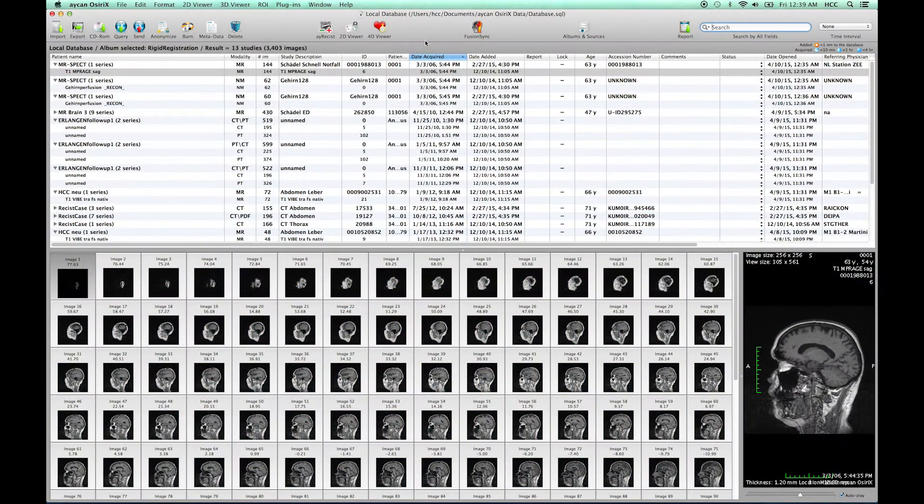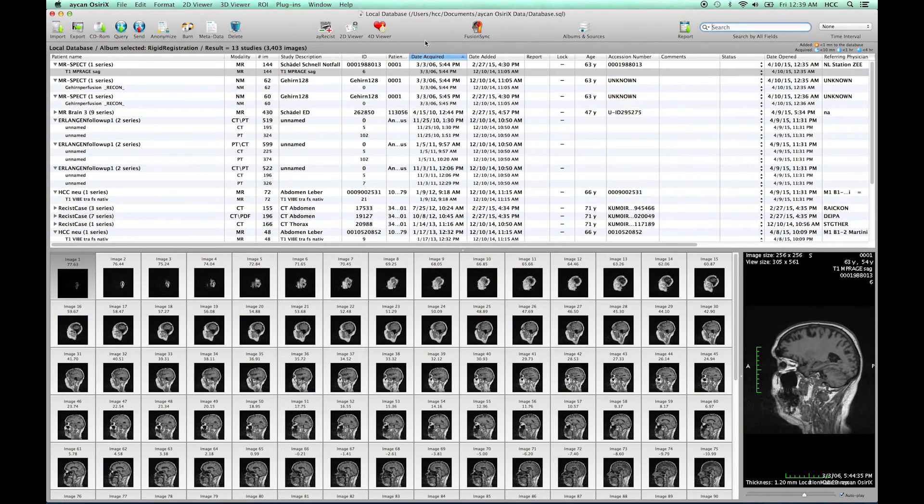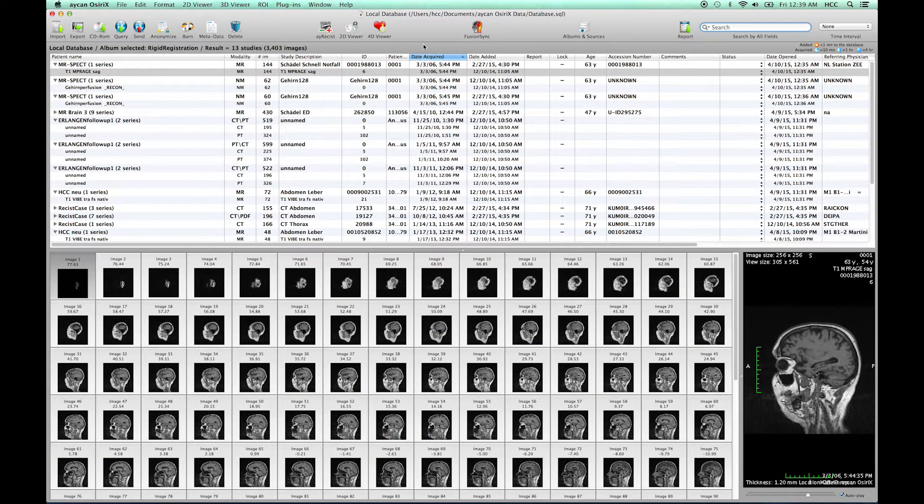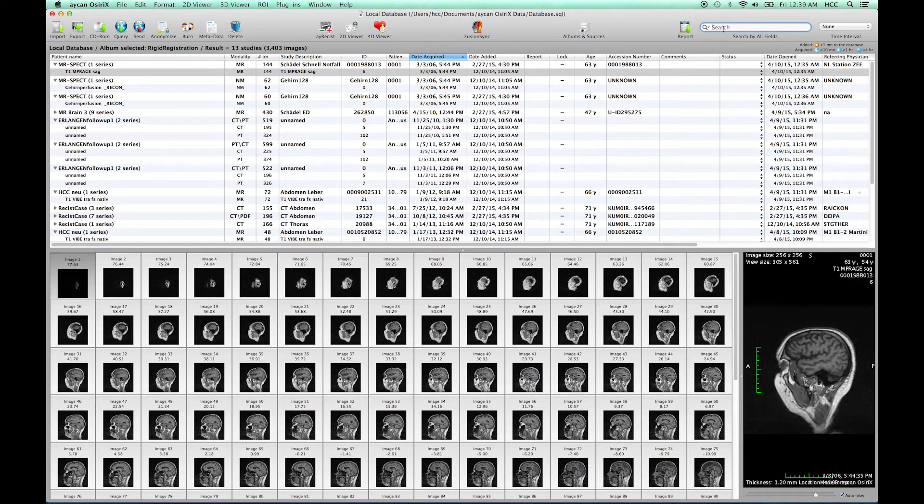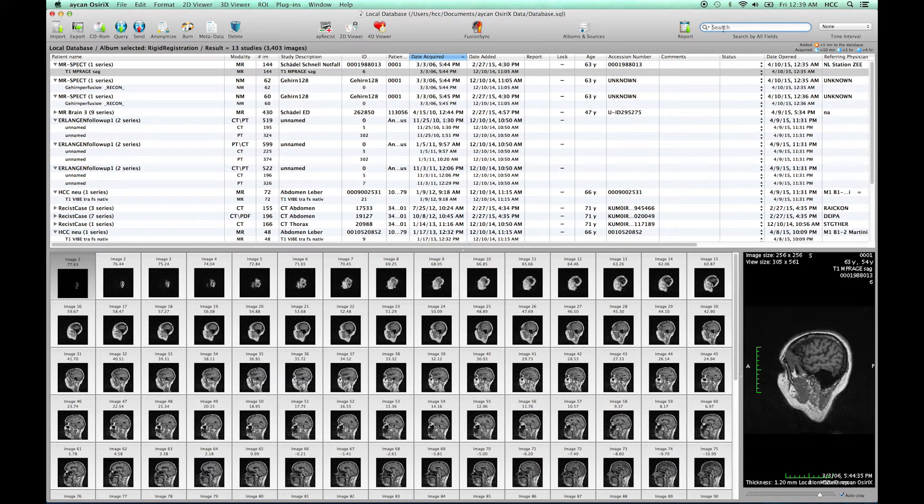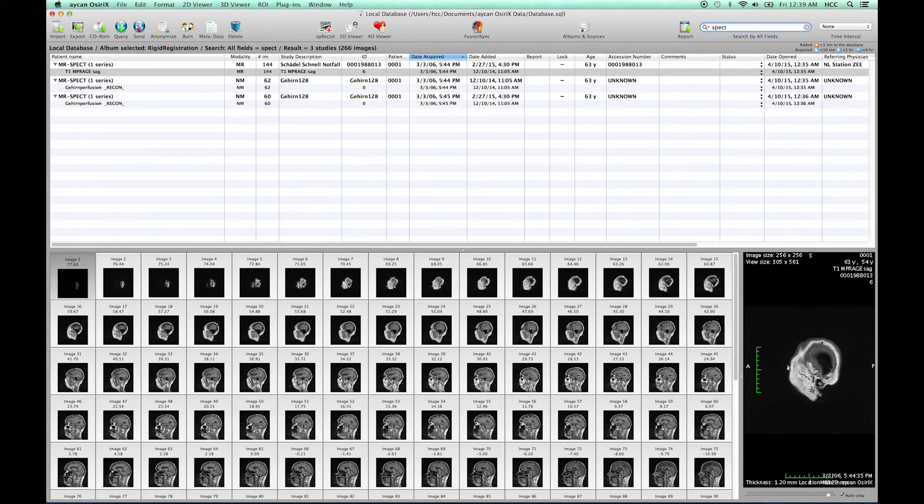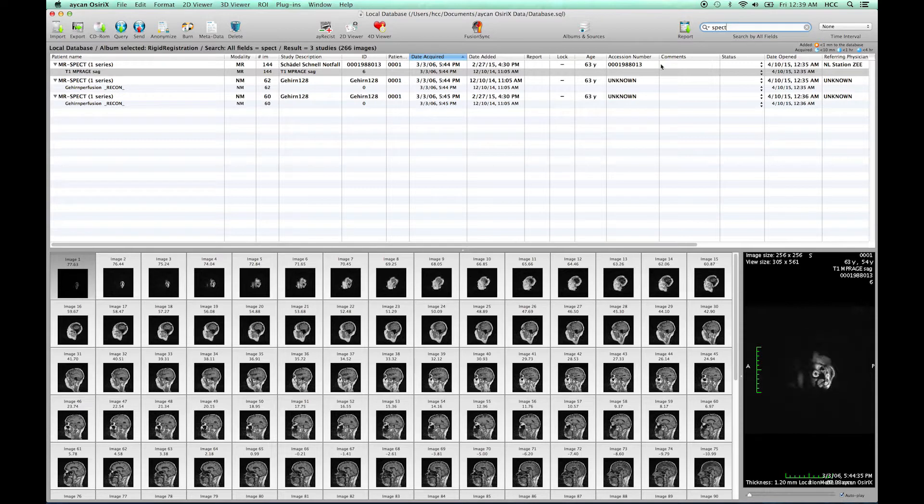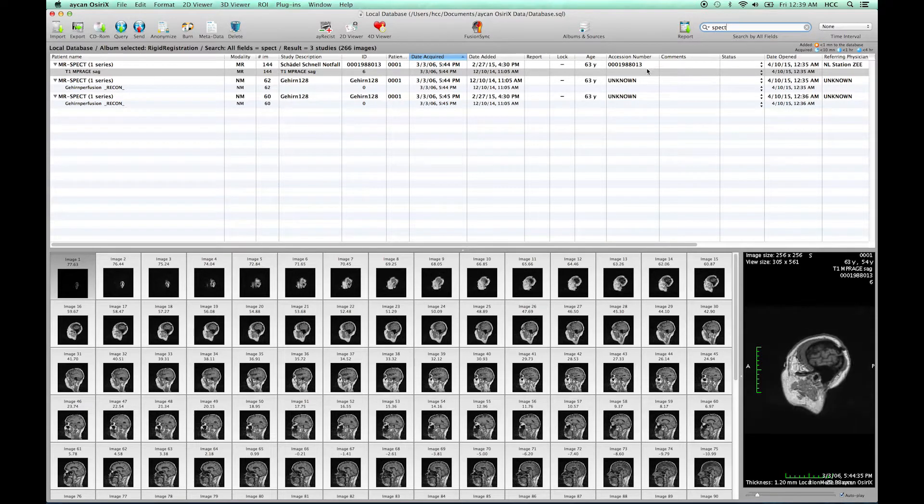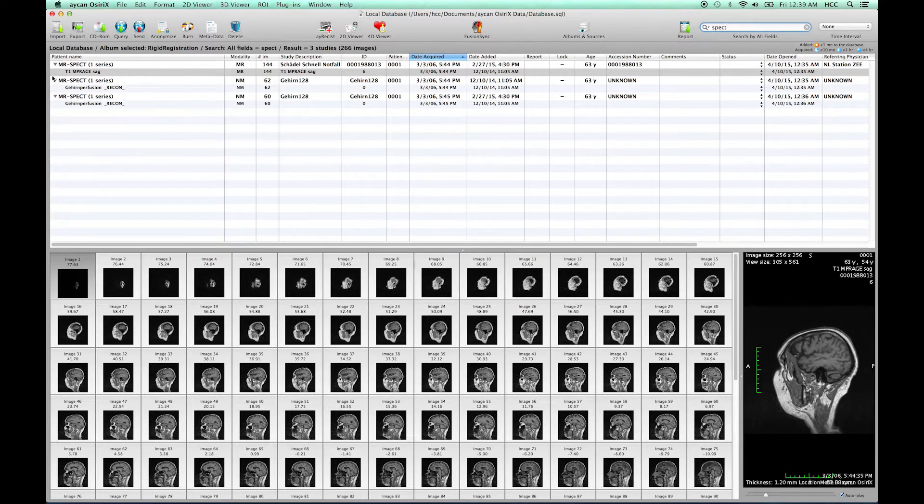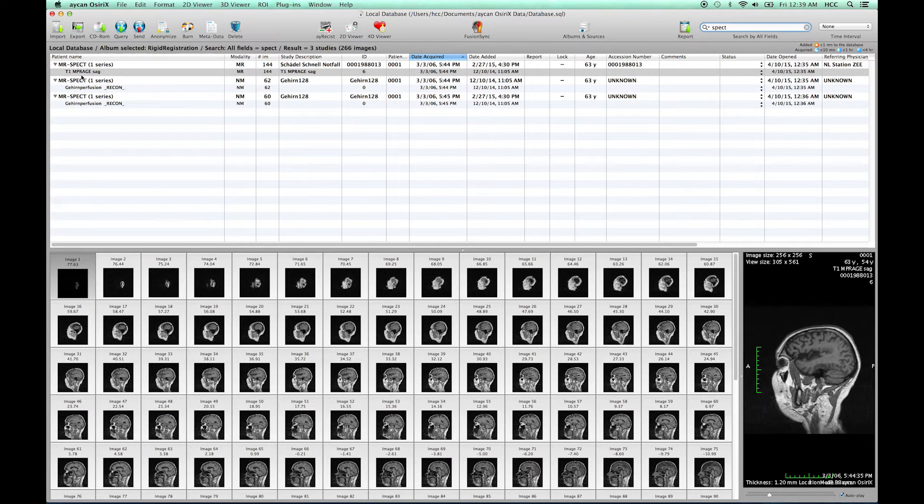Hello and welcome to part 2 of the FusionSync video tutorial series. In this video I quickly demonstrate how to use FusionSync to compare interictal and intraictal SPECT epilepsy images with a previously acquired MR scan.